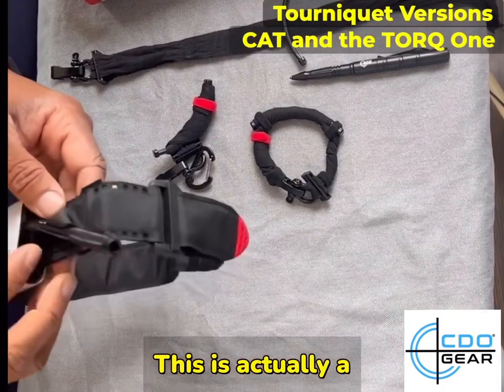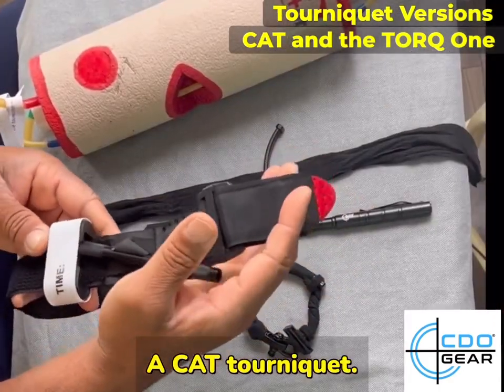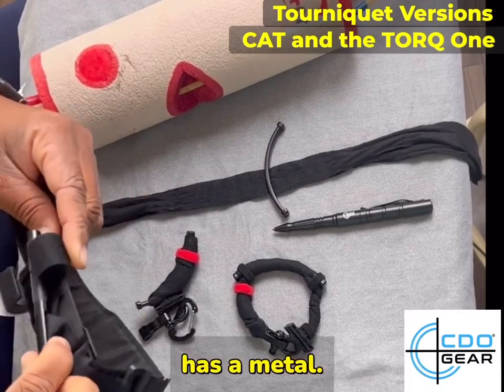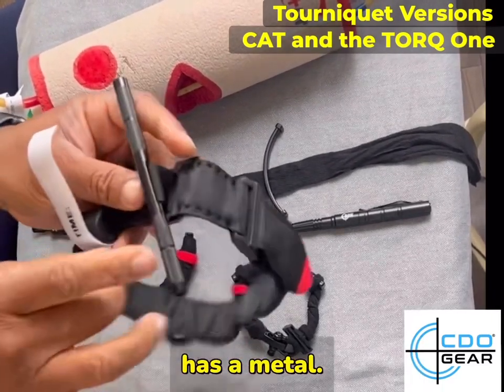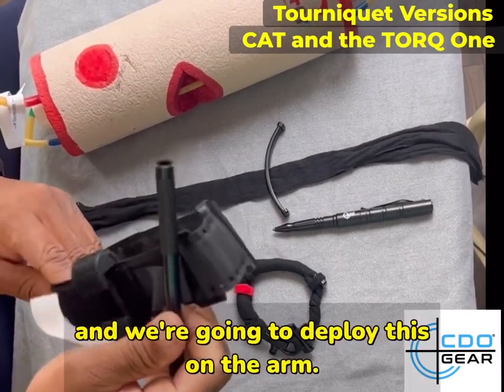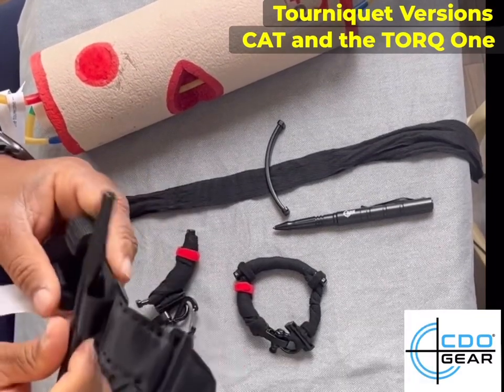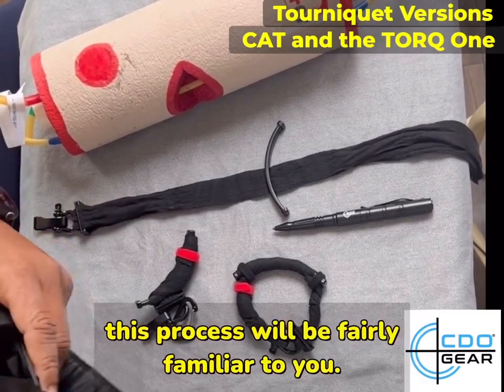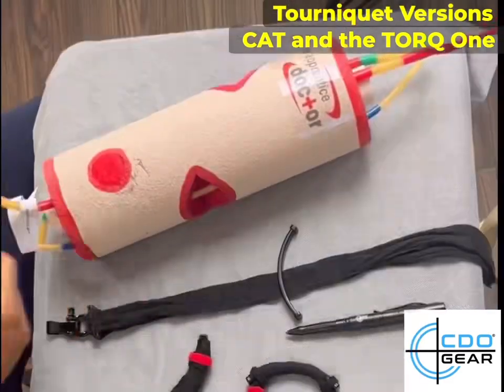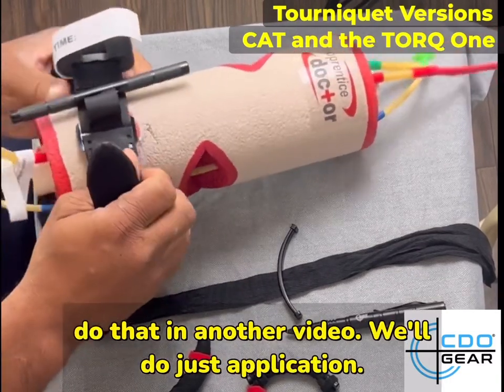This is a CAT tourniquet, and this one particularly has a metal windlass. We're going to deploy this on the arm. If you're familiar with this tourniquet, then this process will be fairly familiar to you. This is a makeshift arm — we're not going to do a bleed on it right now, we'll do that in another video. Just application.